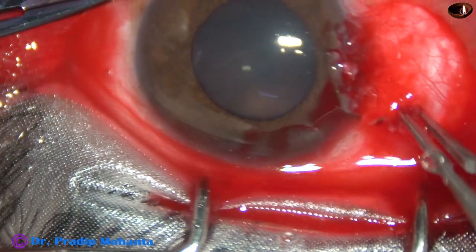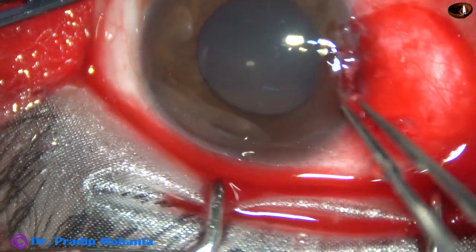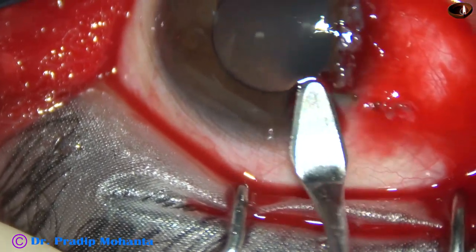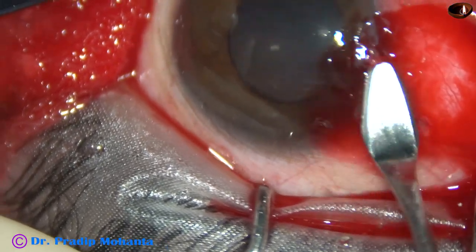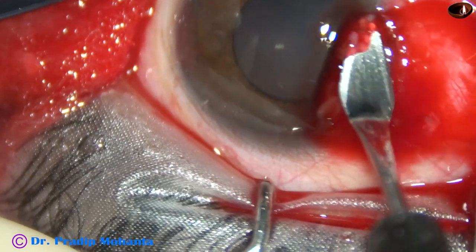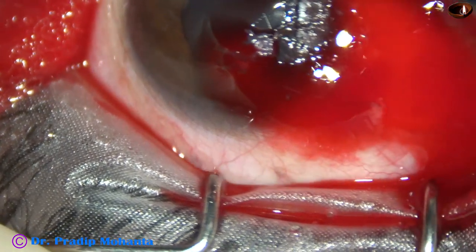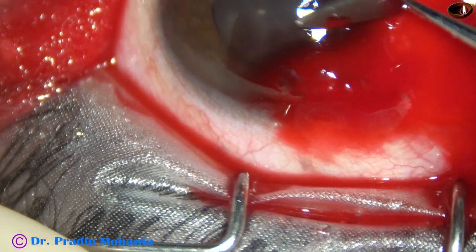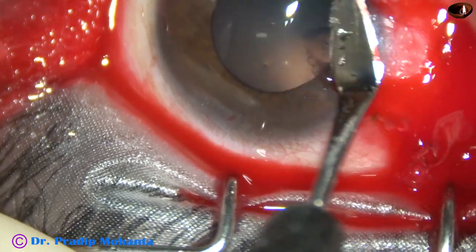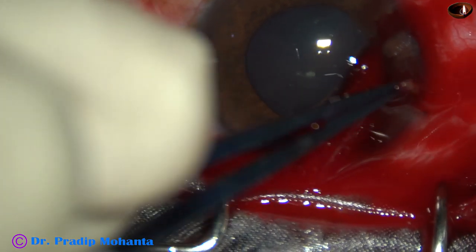There is some bleeding, but I am not going to use cautery. Cautery has produced a lot of untoward effects in the past — scleral thinning, scleral necrosis, and scleral melting. So I have stopped using cautery in pterygium. Even if it bleeds, I just let it bleed and it will stop by itself. Remember not to use cautery or bipolar cautery to stop bleeding.